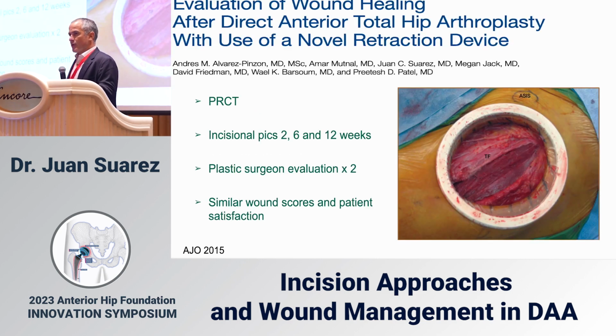What about this ring retractor? You've seen a couple pictures of this. We had a paper on this about 10 years ago. We used to put it underneath the skin. Now it goes under the tensor and the rectus. And we did a prospective randomized trial. We took pictures at 2, 6, and 12 weeks. And we had 2 independent plastic surgeons rate them with some specific scoring system. And the scores were the same. There was no difference in complication rate, so we kind of abandoned the use of that.